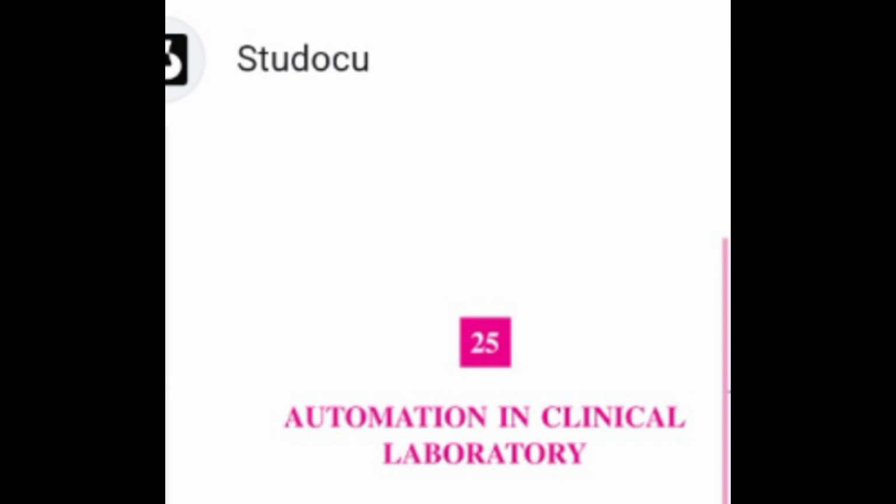The productivity, quality, and safety have subsequently improved dramatically for those laboratories that have properly introduced and managed their automation. However, automation increases the demands on the laboratory in many ways. The analytical instruments are burdened with an increase in the flow of reagents and specimens to be analyzed.